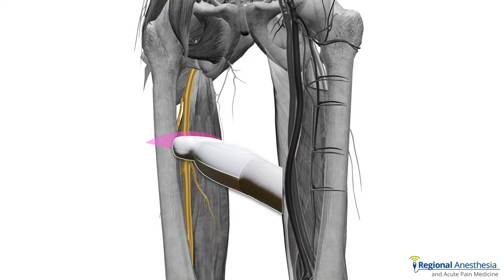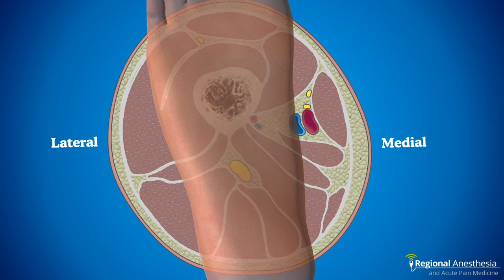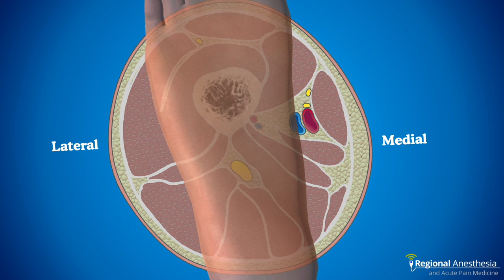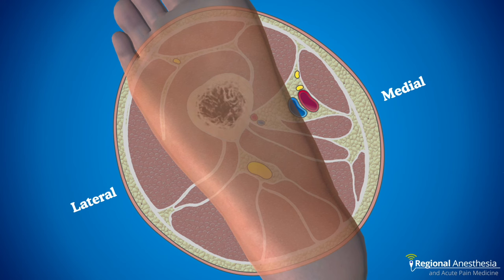Here's where we're going to scan for the anterior sciatic block — about 10 centimeters from the inguinal crease, approaching from the anterior medial thigh. To get there, it's useful to externally rotate the thigh or frog-leg the patient if possible. We often do these in patients with external fixators on their calf or ankle, and movement can be limited.